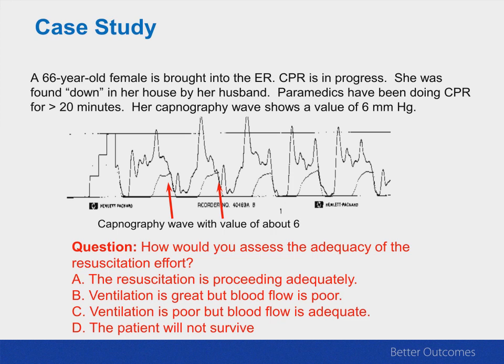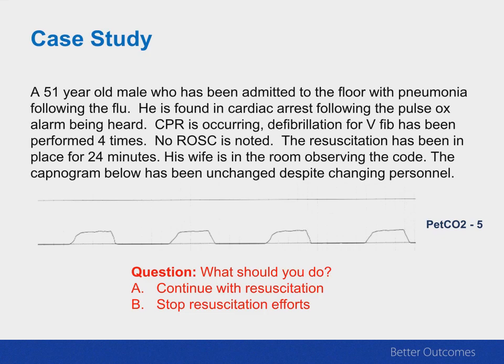If I had asked you, do you think we're doing a good job? Is ventilation great but blood flow poor? Will the patient survive? Well, the answer is this: if you have an end tidal of 6 after 20 minutes of resuscitation, the chance of this person's survival is so low as to almost be not measurable. And so the recommendation would be to stop the resuscitation effort.